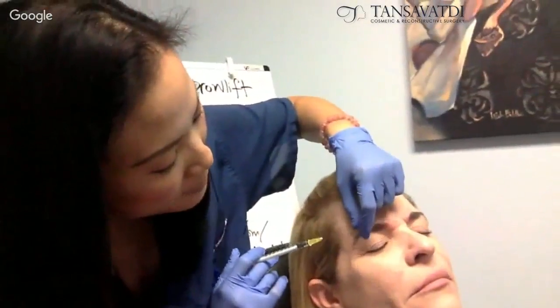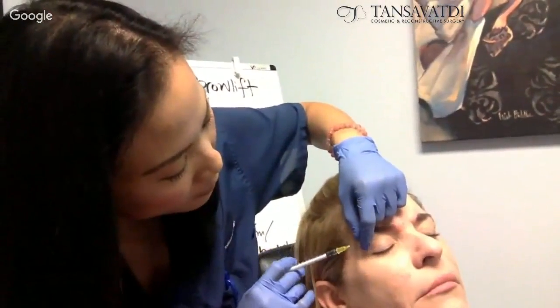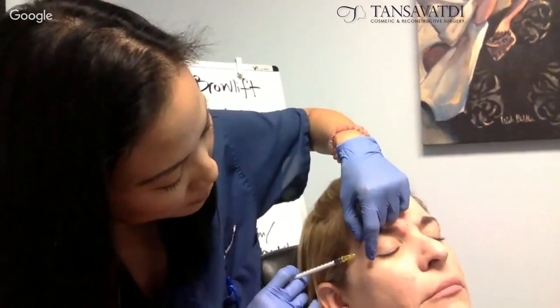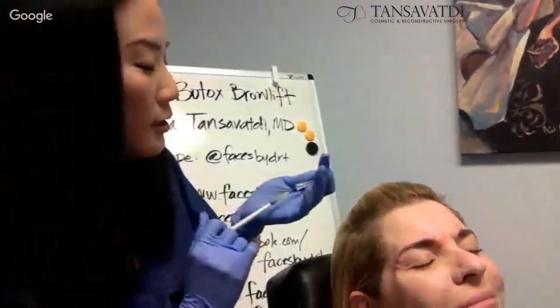And the last part is the lower orbicularis on this side. She's squinting, she's showing me. Relax. And so I'm going to get that right there. And the rest. Perfect. And we're done.